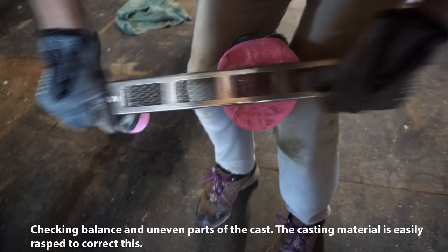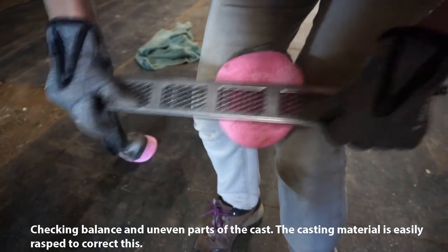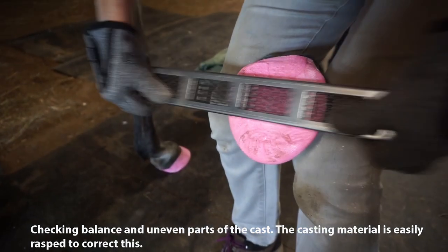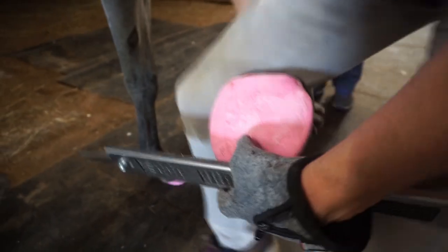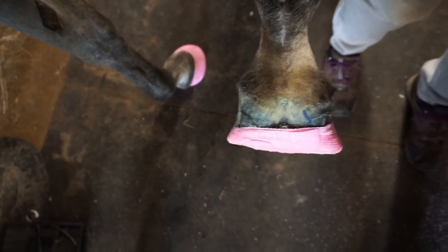There's a little piece sticking up there. So you can rasp these. So I'm just kind of smoothing that out a little bit. There we go, and I'm gonna take a look. You don't need to do this with the camera, but that's much better. Whoops, I took out that little nubby. Okay.